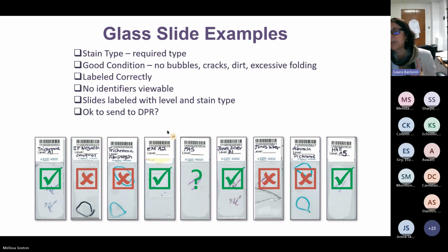If the label is put in the back, though, now you have a different issue, because you have a label and then you put a blank label on it. Now you have 2 labels. Now your glass slide is no longer flat when you put it in the scanner, but a little bit tilted, right? The scanner has to focus.